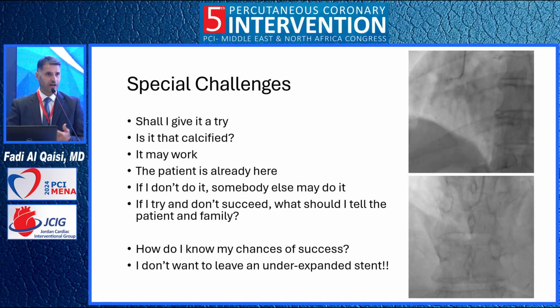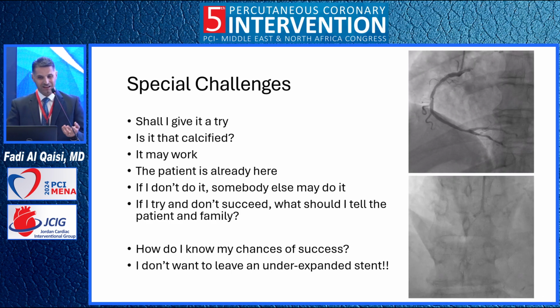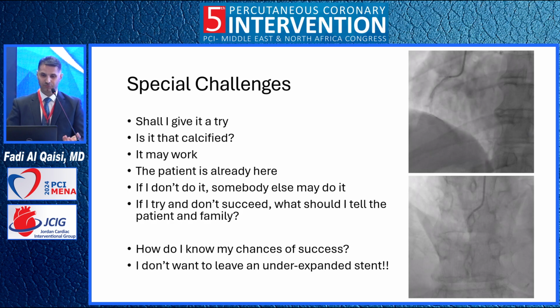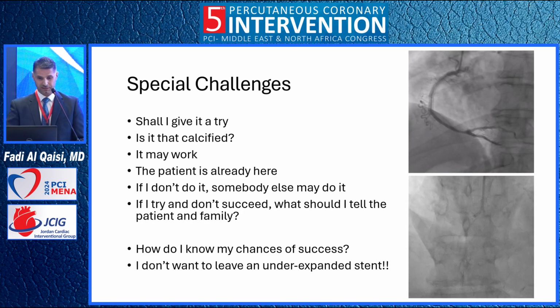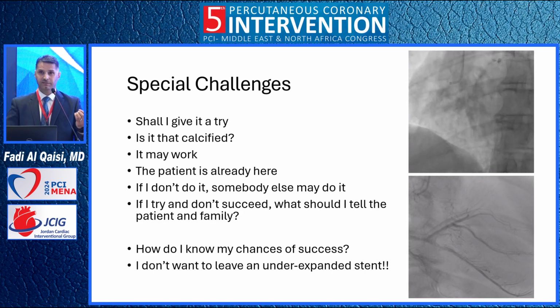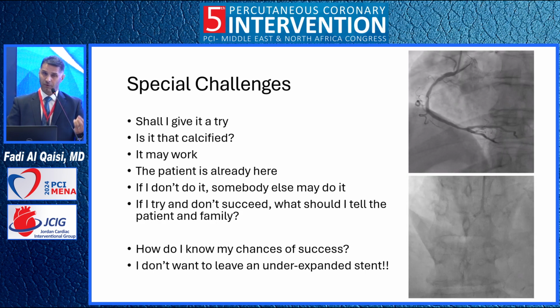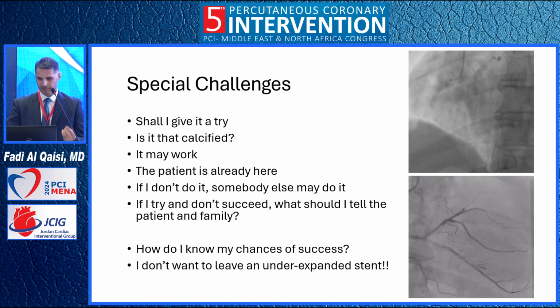If I don't do it, he will take the CD and tour Amman, or somebody else will do it. If I try and don't succeed, what do I tell the family outside? I tried, I opened equipment, what do I tell them, that it didn't work? What are my chances of success? And the most important challenge: I want to work it, but yet I don't want to leave behind me an under-expanded stent.